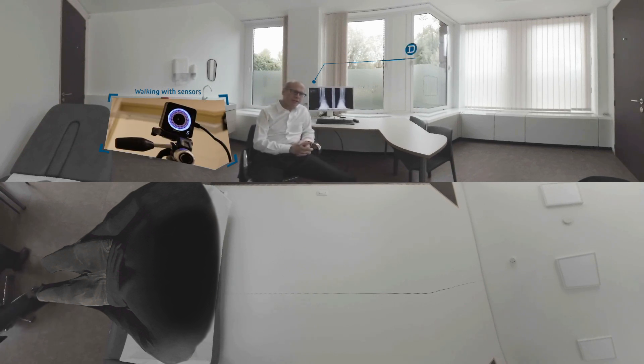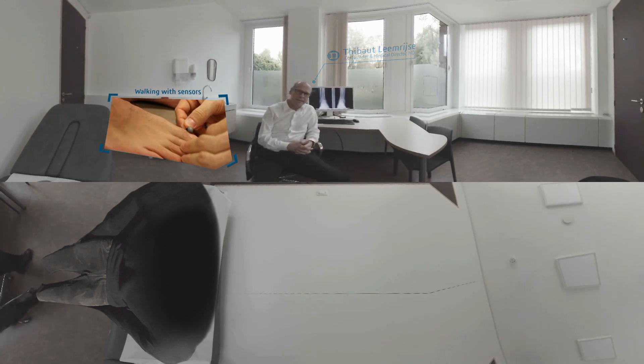We collect a lot of information with our clinical decision support system — for example the quality of life, the function of the ankle, and the localization of pain. With all this data we can reproduce the pathology by simulation. It's like a clone which we can simulate and validate the best surgery for the patient.